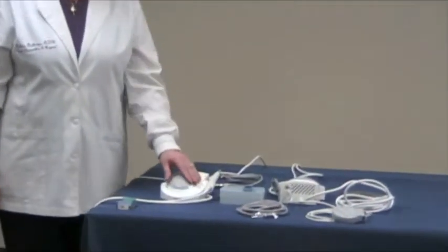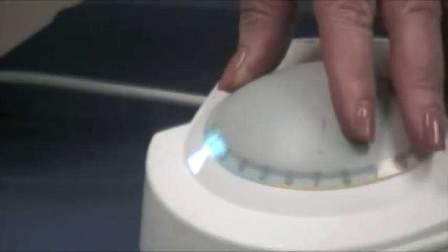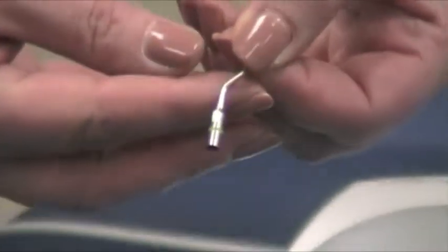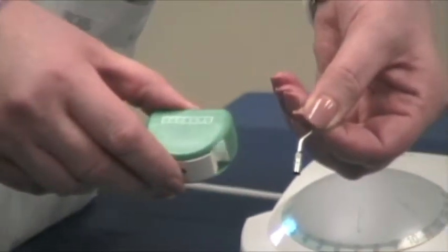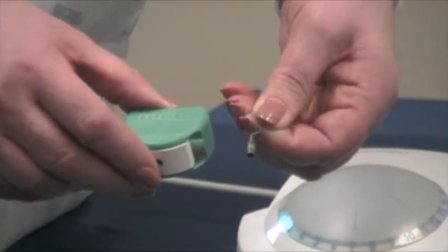The dial is where we get our color-coded system, starting with our first level, which is green — low power for our perio tips. Here's an example of one of our most popular perio tips. As you can see, it has a green band, so you're ensured to be with the right tip and the right power level. Our green wrench matches directly to it to complete our color-coding system.